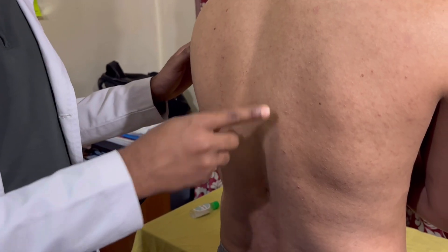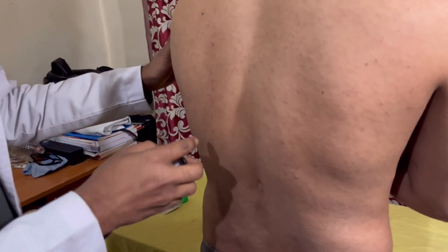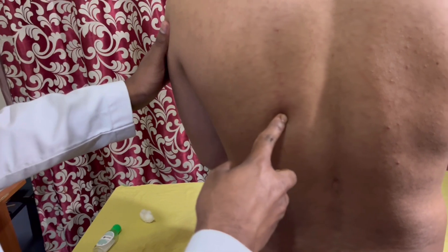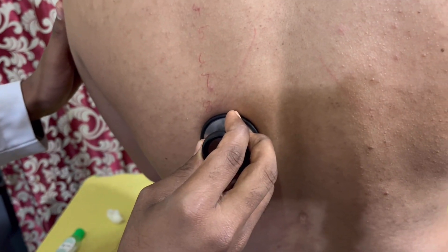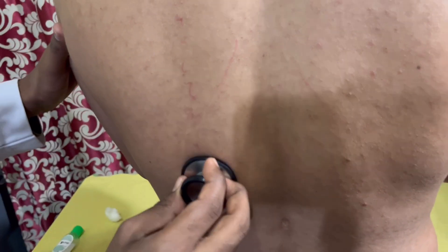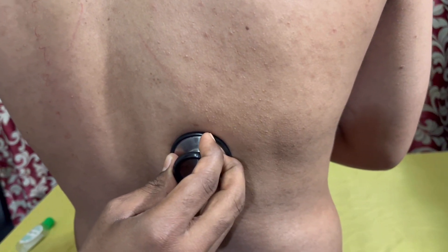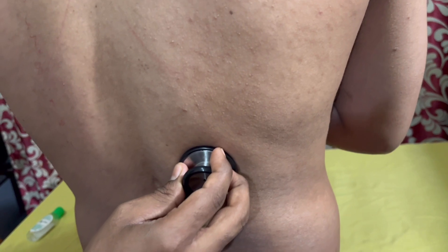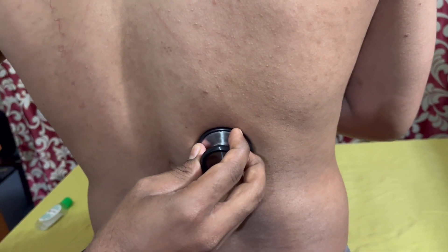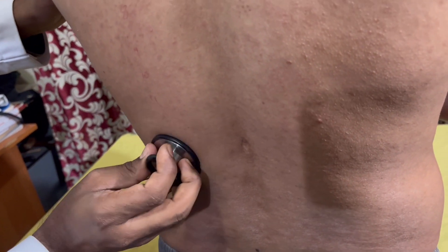Then we auscultate the subscapular region. First, the eighth and ninth intercostal spaces on the right side, then the left side at the eighth and ninth intercostal spaces. Then the tenth and eleventh intercostal spaces.